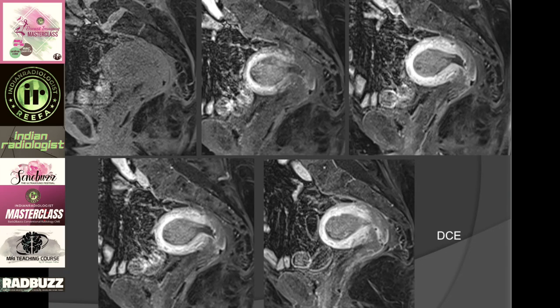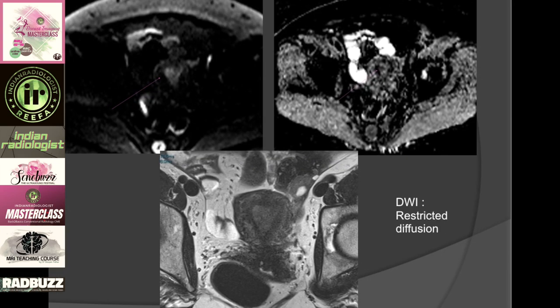When we administer contrast, we can see the tumor is enhancing earlier than the normal endometrium, which is here, but it is slower than the myometrium. So the first structure to enhance is myometrium, then the tumor, and then the endometrium. At about 50 seconds, we have maximum contrast between the normal myometrium, the tumor in endometrium, and the normal endometrium. This is just another image of another patient.